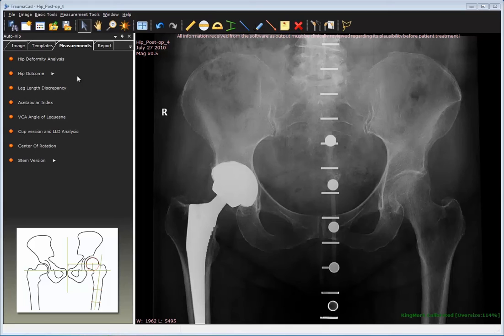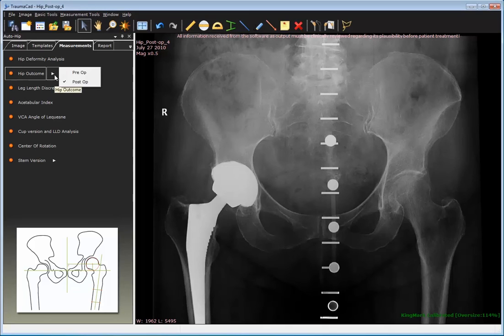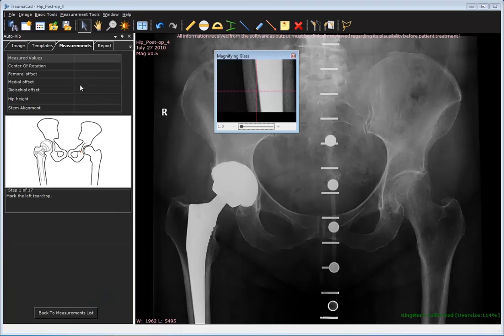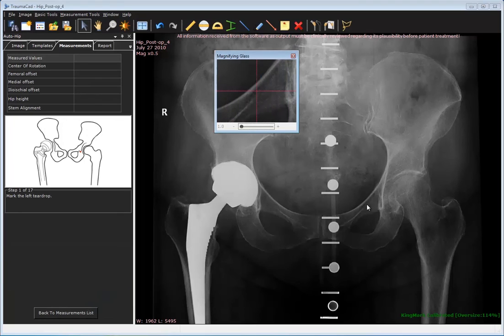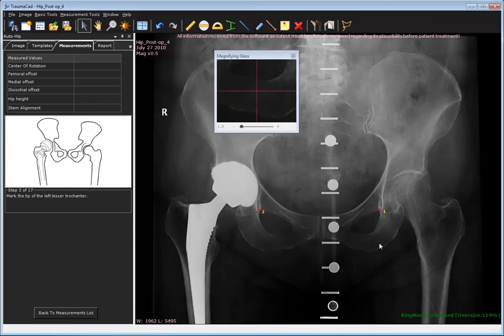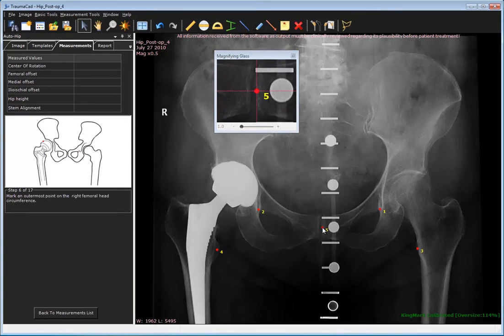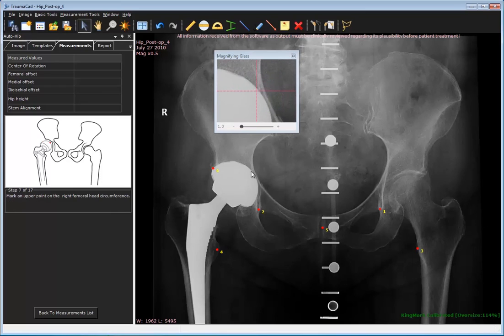Next, perform the measurement on the post-operative image. From the Measurements tab, select the Hip Outcome option and then select Post-Op in the submenu. Follow the wizard again and mark the anatomical landmarks.